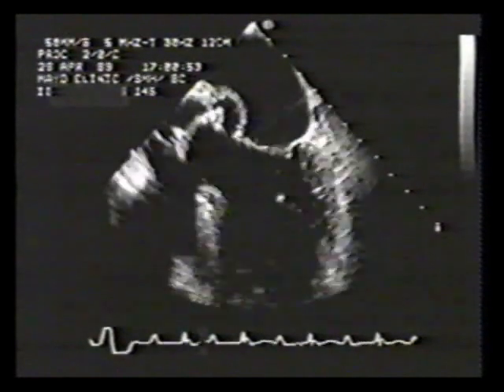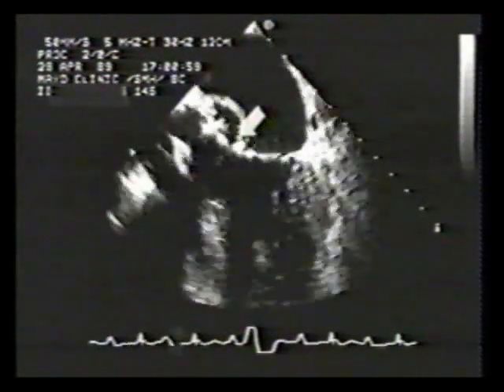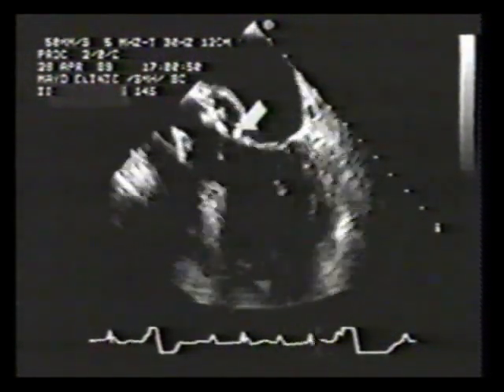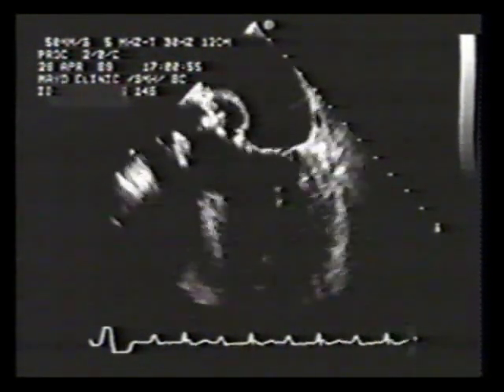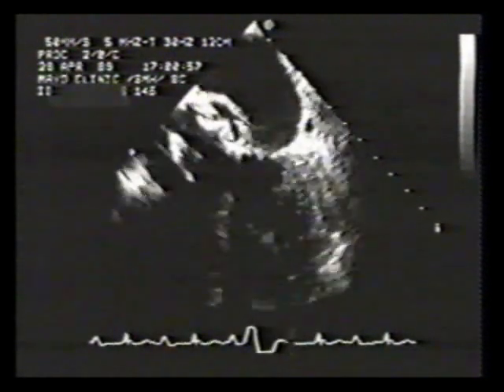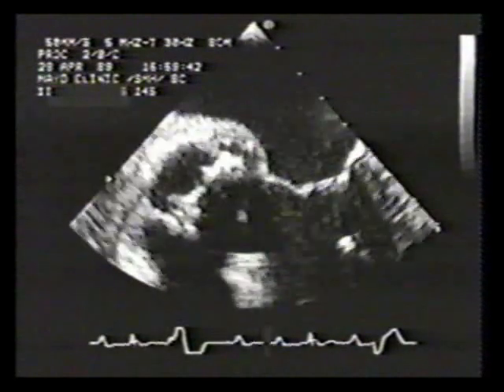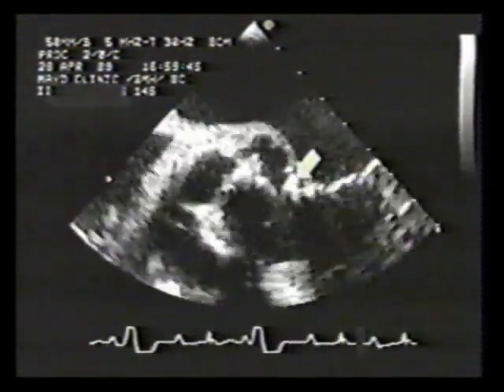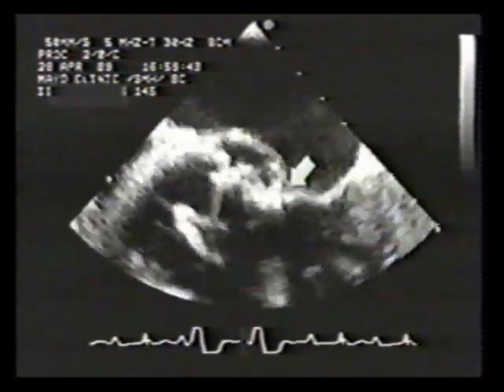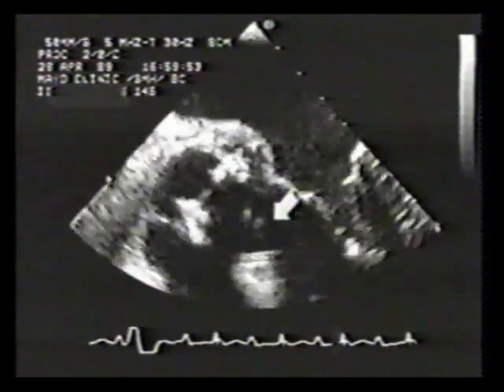Note that there are small pedunculated vegetations attached to the bioprosthetic cusps. The abscess is located posteriorly. The vegetations prolapse into the left ventricular outflow tract. The abscess appears expansile, suggesting communication with the left ventricular outflow tract. On expanded or magnified views, notice the mass is expansile. You can see portions of the bioprosthetic cusps and the adherent vegetations.